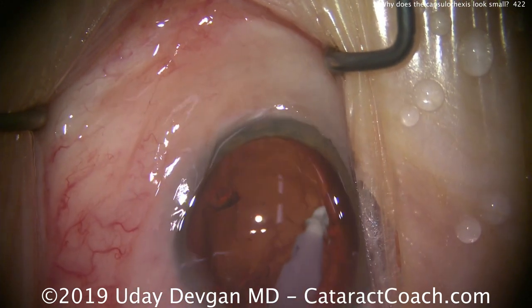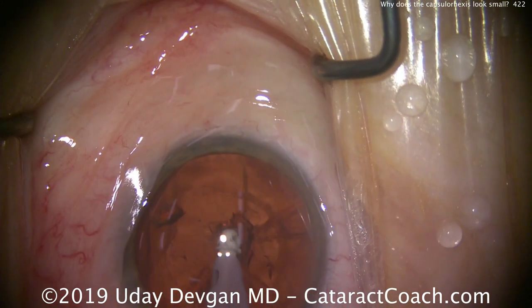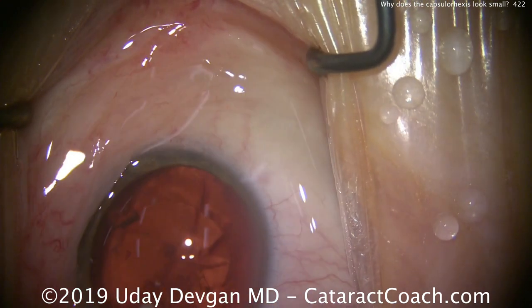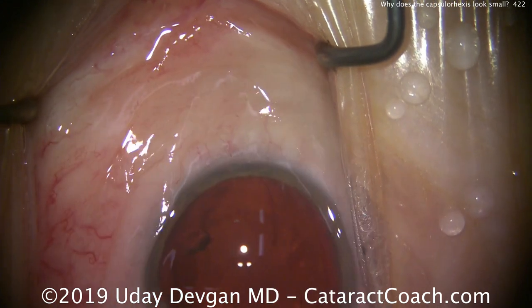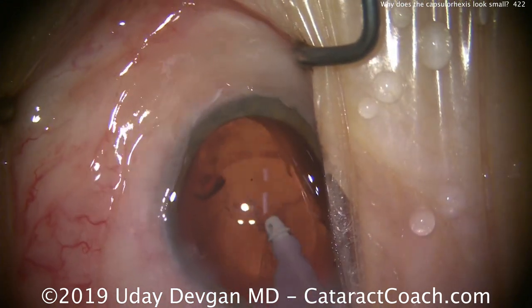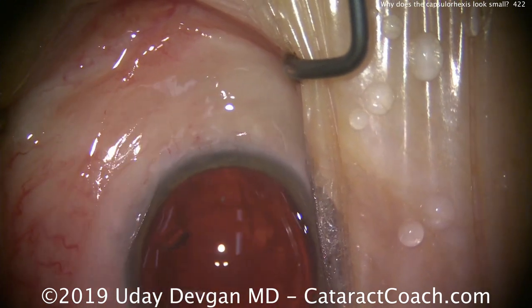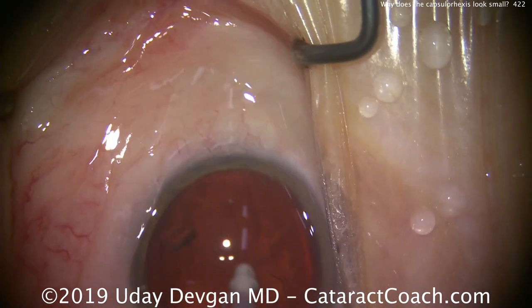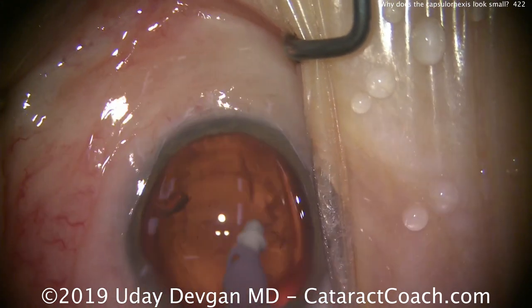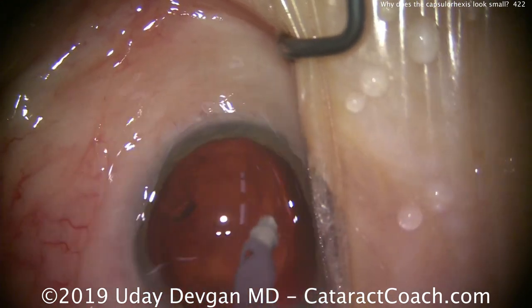A ruptured posterior capsule with vitreous prolapse in a large myopic eye carries a very high risk of retinal break and retinal detachment. So definitely be very judicious and very cautious here. If you have to leave a little bit of lens scar tissue or adherent lens material, certainly don't risk breaking the capsule bag. So clean up all the cortex nice and easy, then we'll get ready to put our lens in.